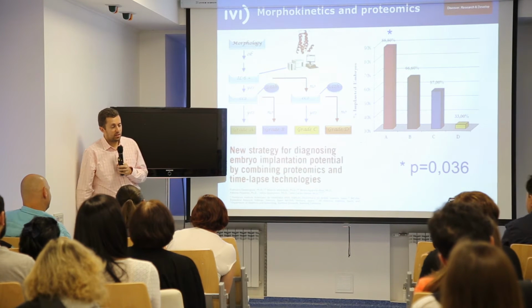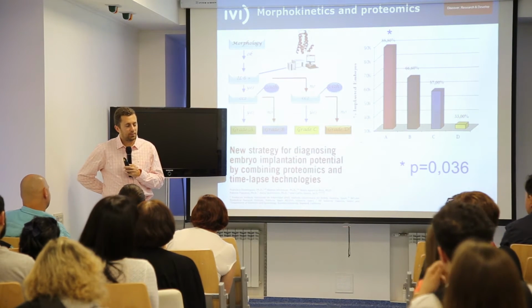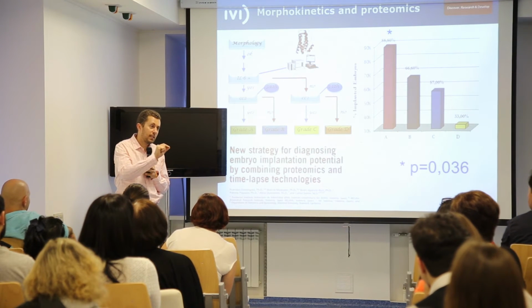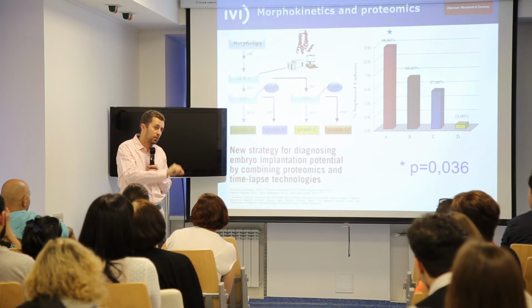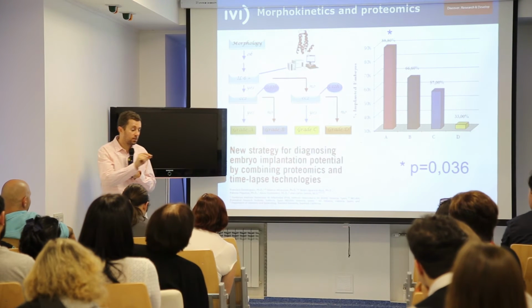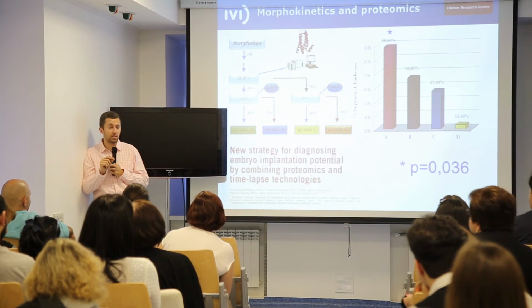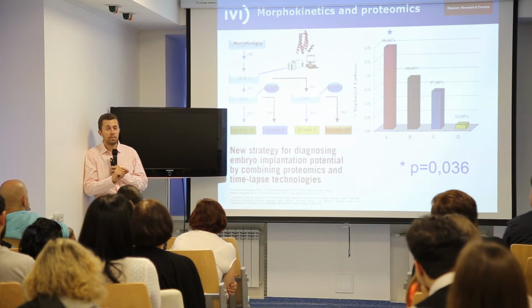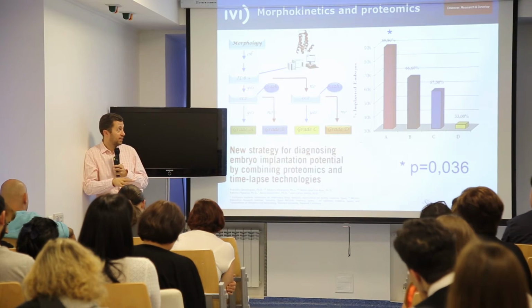This is pure research, but who knows what will come in the future. In that study, we have the capacity to analyze the culture media of the embryo and measure the proteins that were present there, and look if we were able to combine that with the times in order to select better.